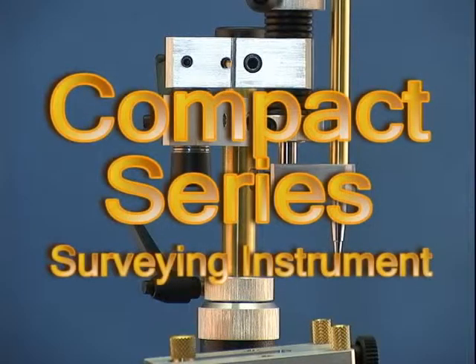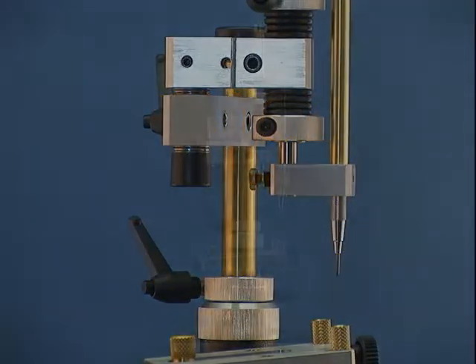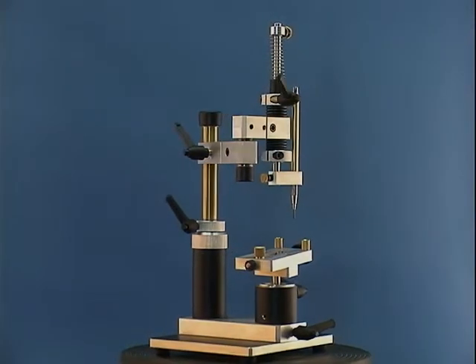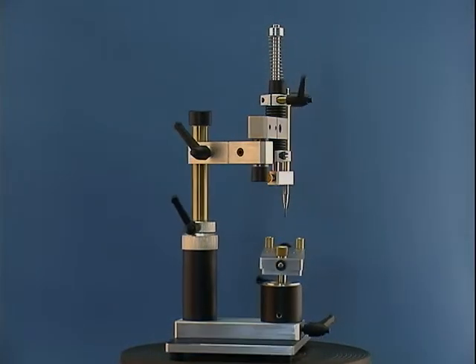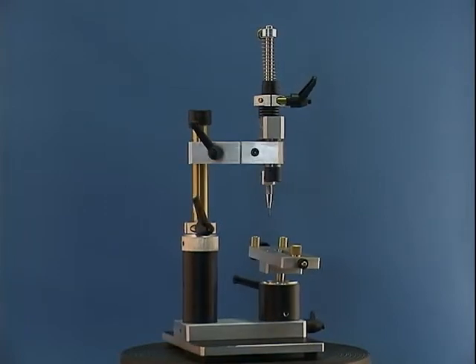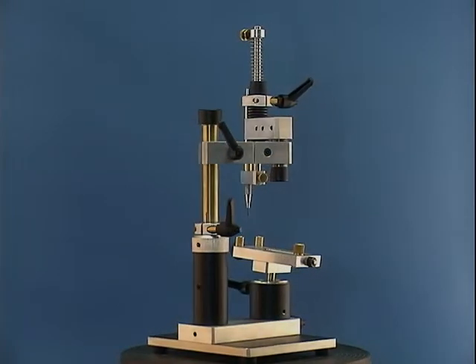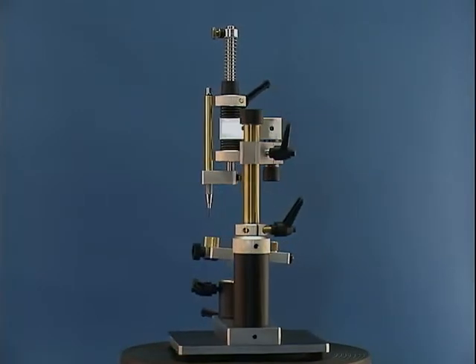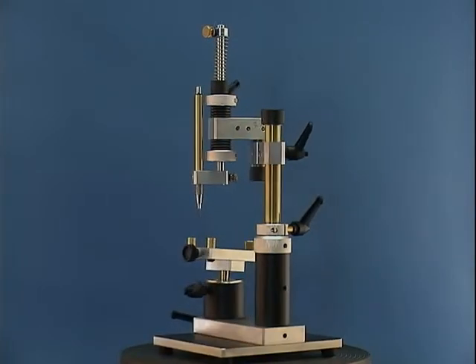Our compact surveyor mill series functions similar to our MX series. It's just in a lighter and smaller format. This makes it ideal for crown and bridge, removable partial denture labs, as well as doctor's offices. When not in use, it can be easily stored away.